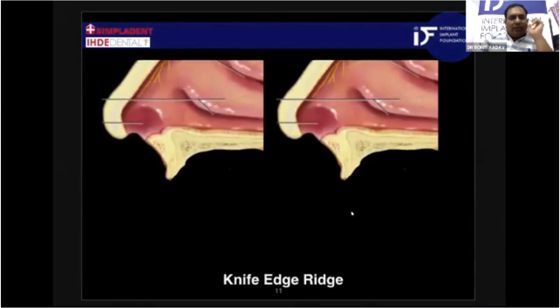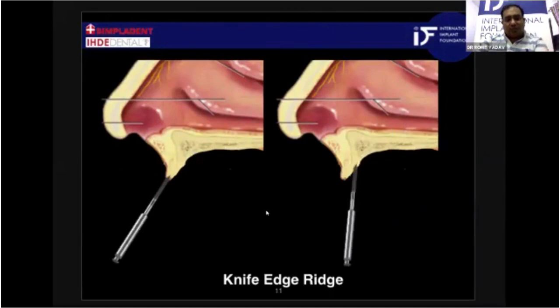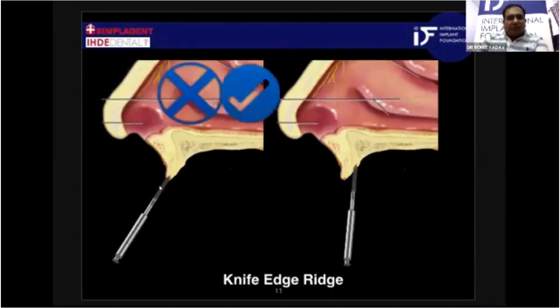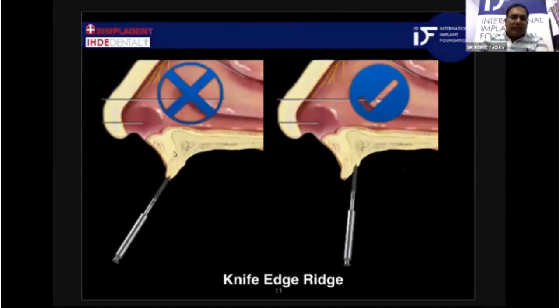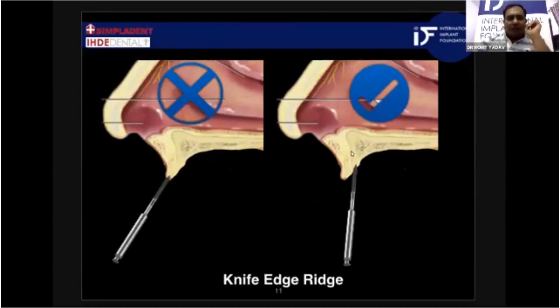Frequently in clinical practice, you will come across knife-edge ridges. In such cases, you don't follow the inclination or angulation of the ridge. Instead, you go in such a way that the palatal wall of the ridge becomes your buccal plate. You go more vertically so that you get stable bone throughout the way, and the implant can be inserted in the desired direction.